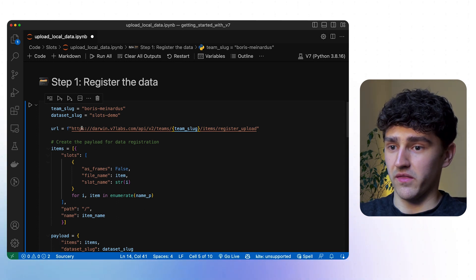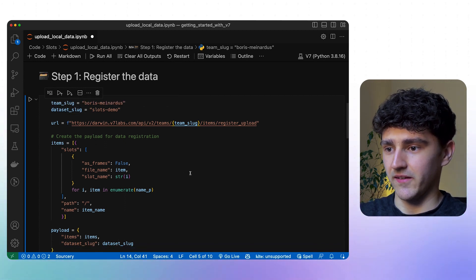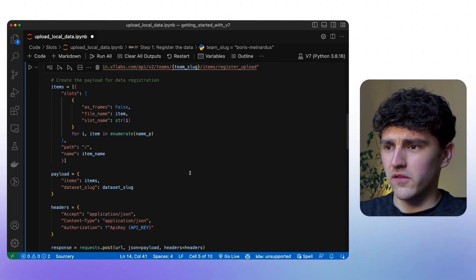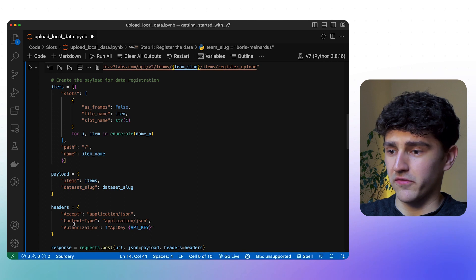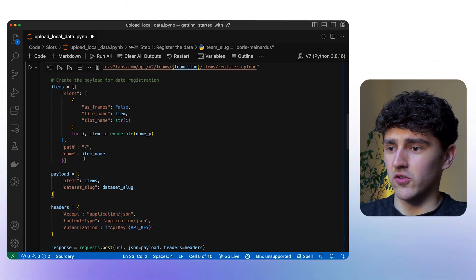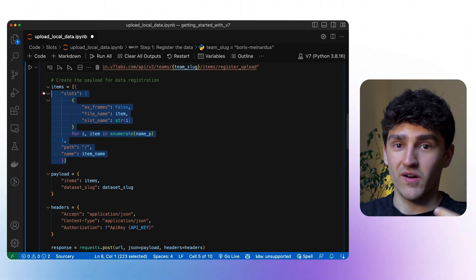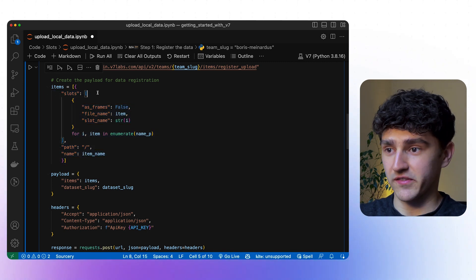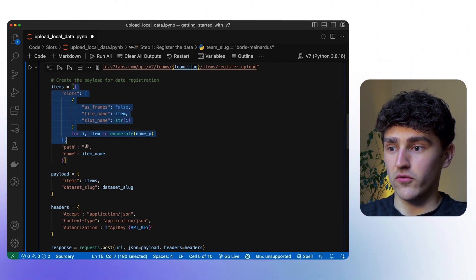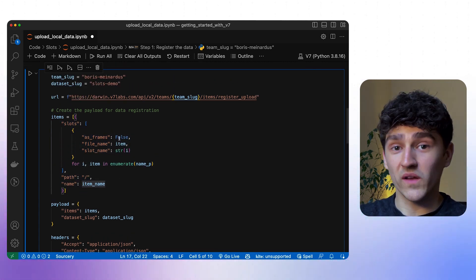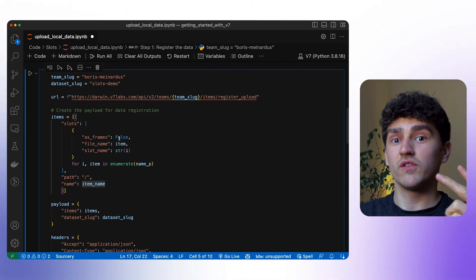To do that, we specify the URL providing our slugified team name and the dataset slug. For the payload, this is the part we have to tweak a bit compared to the standard upload video. Since we are working with slots, we have to provide all the different items in their specific slots. We have a list of all items — in this case, one breast item that has two images inside it, meaning two slots for those images.